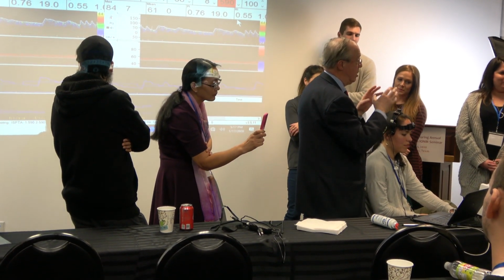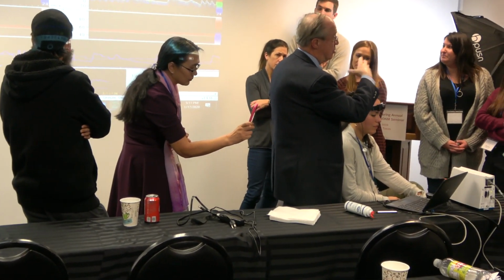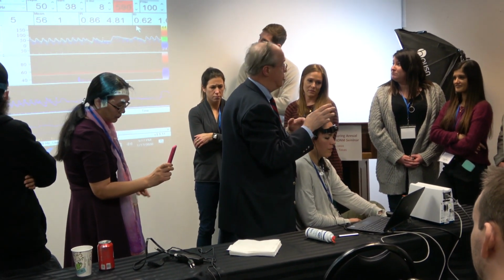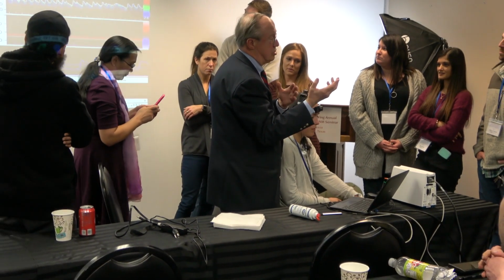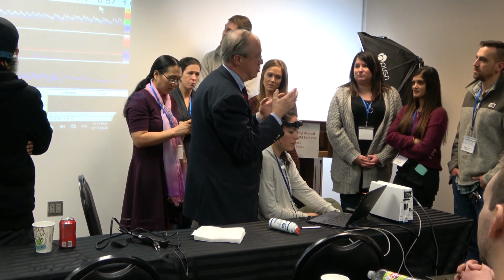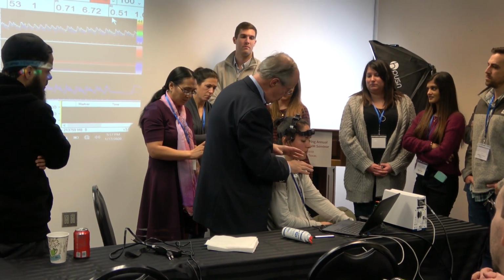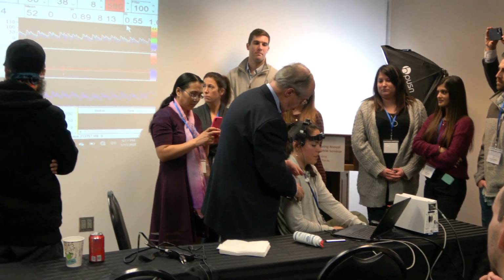Why change sweep time? We have more time on the screen and you can see what is going on. And again, we talked with you about so-called cerebrovascular reactivity testing, for example, which is secondary indication of the status of cerebral blood flow autoregulation. And for example, we can ask Esther now, breathe normally at one, and then just stop breathing and hold breath. Don't breathe.